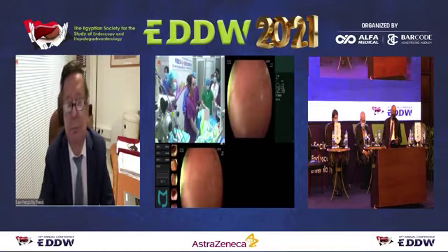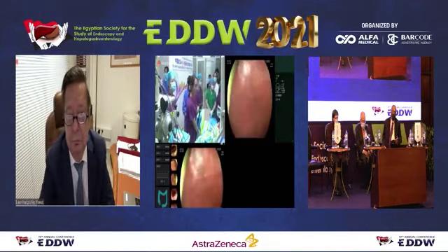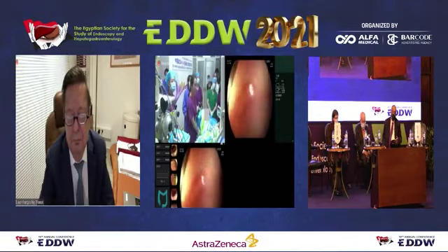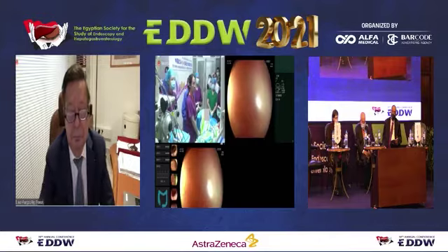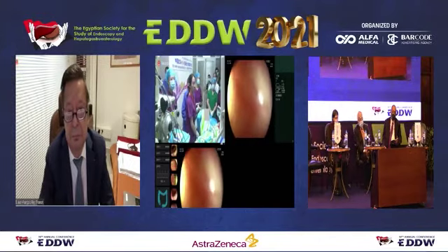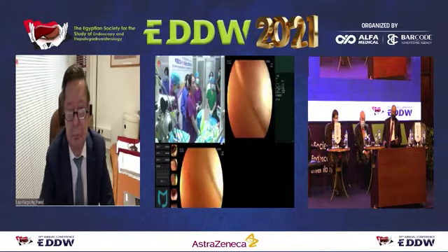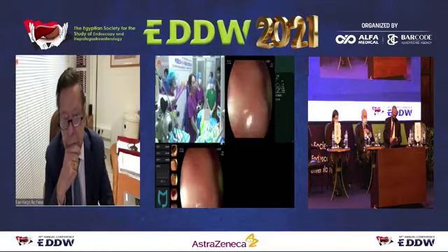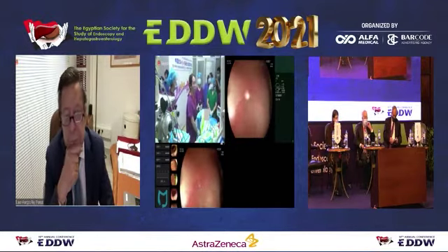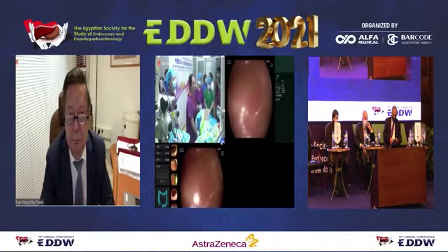Professor Liu Jing, I have a question. Which mode do you usually use to detect polyps? For routine screening, we usually just use white light.